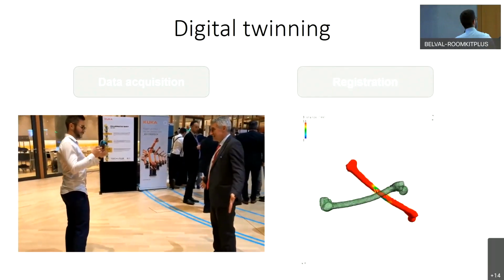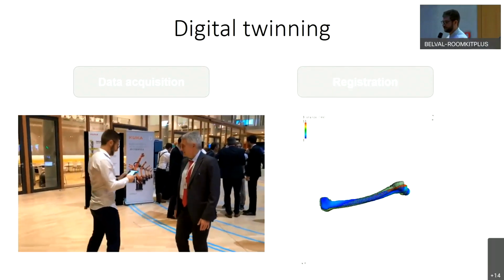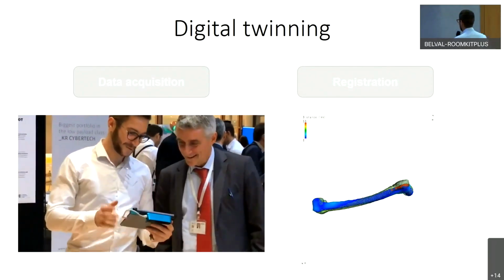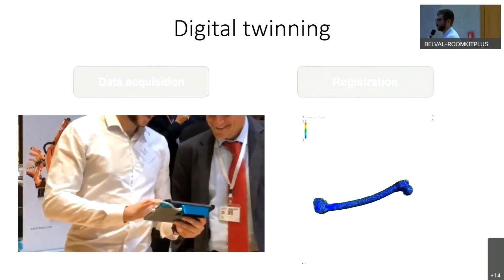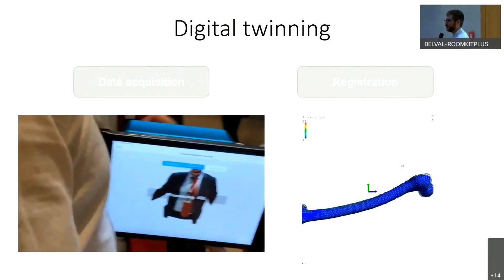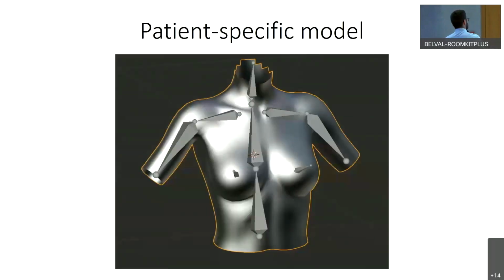Then we will use registration. Registration is the act of deforming a model to fit the patient's data. Here, I'm showing it on a bone, where we deform one bone to fit another patient's bone. But the bone is quite a simple geometry compared to the breast.